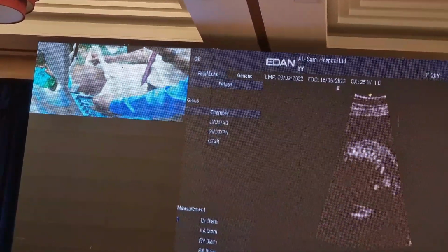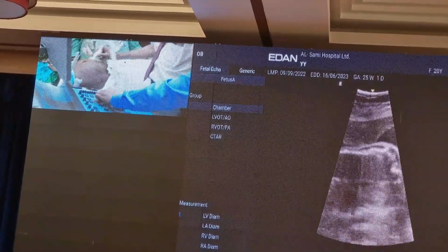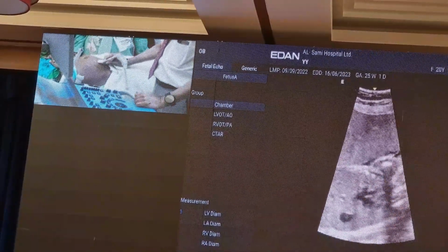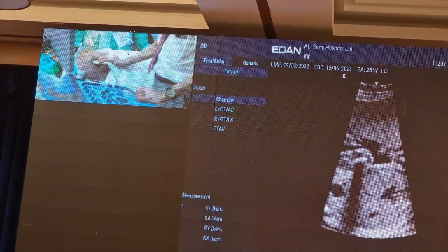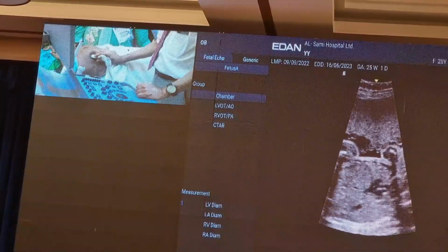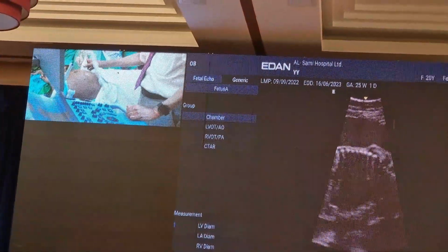Yeah, out. So when you zoom out, reduce. Yeah. Chota kara. Yeah, in Marathi also we call it chota kara. Same. The word is the same here. It's just like little here and there.